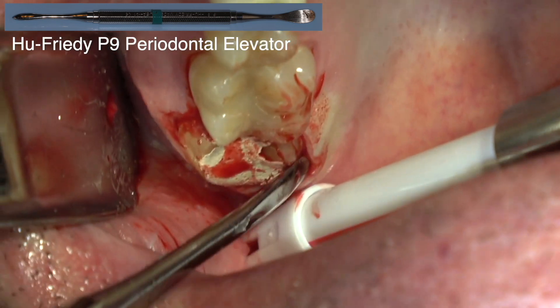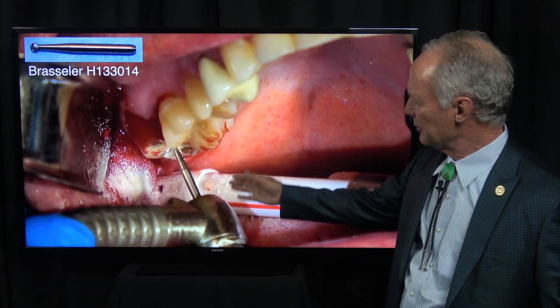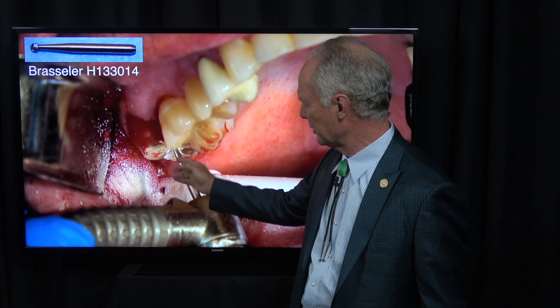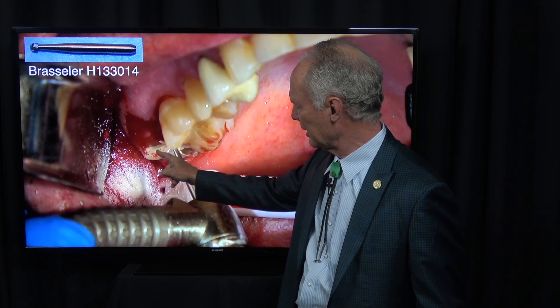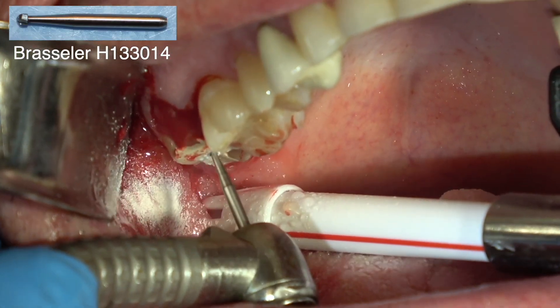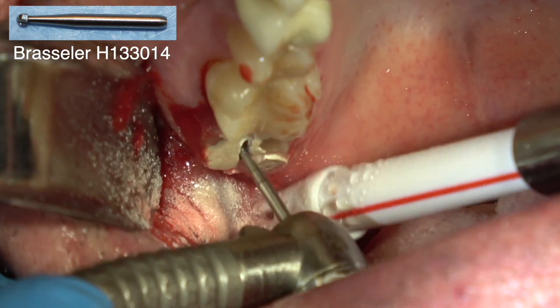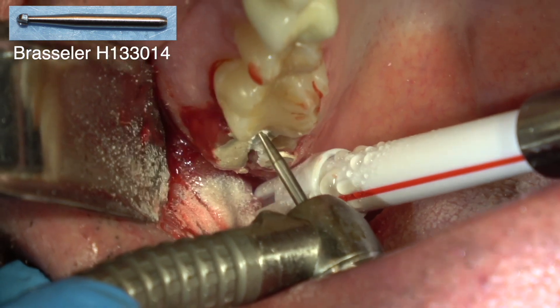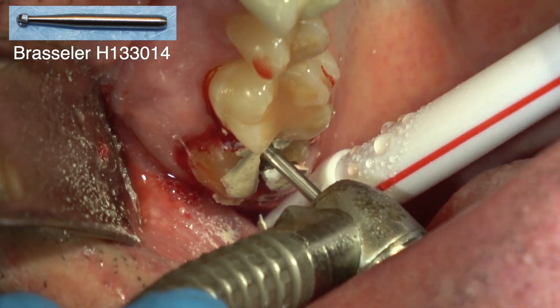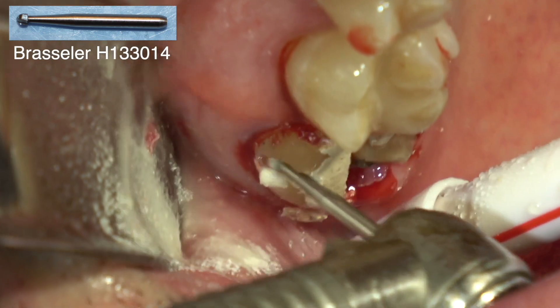Reflecting a full-thickness flap. I'm first cutting mesial to distal right down the center of the tooth, separating the palatal from the mesial buccal and the distal buccal roots. You want to cut all the way into the furcation — be sure you cut all the way through the coronal part of the tooth into the furcation with this burr. This is about a number four to six long-shank round burr, with a lot of water, and just cut all the way through.